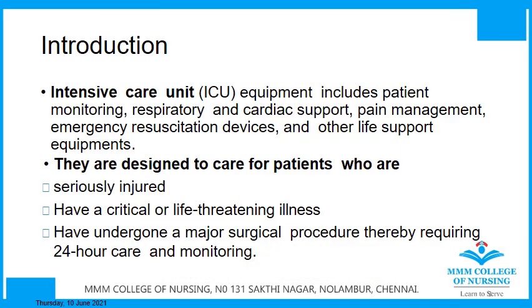Introduction. To introduce, an intensive care unit comprises not only of patients but also the equipments which play a vital role. Mainly the equipments used are the respiratory and cardiac support monitor, pain management, emergency resuscitation devices and other life support equipments. These are mainly designed to care for patients who are seriously injured, those who have critical or life-threatening illnesses, and those who have undergone a major surgical procedure, thereby requiring 24 hours keen care and monitoring.